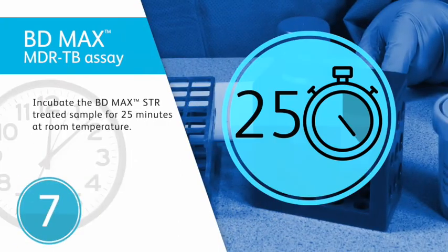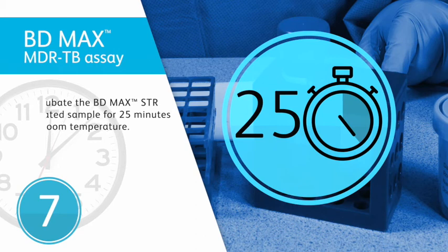Incubate the BD-MAX STR treated sample at room temperature for 25 minutes.